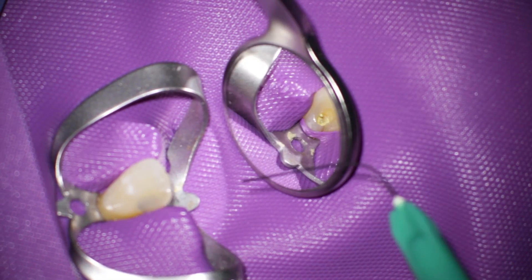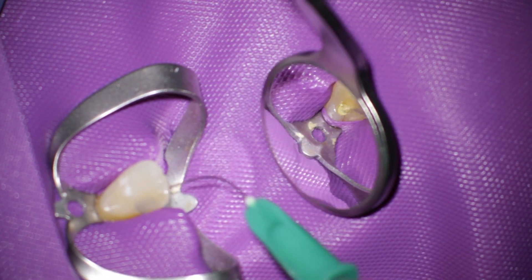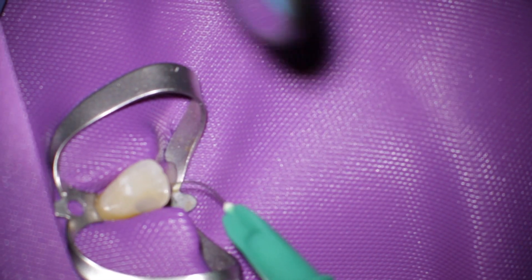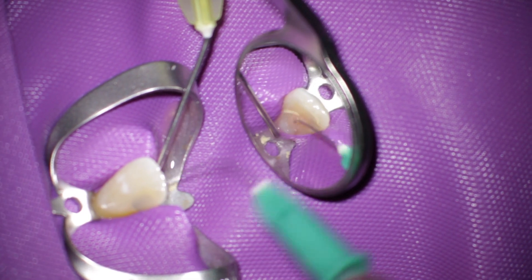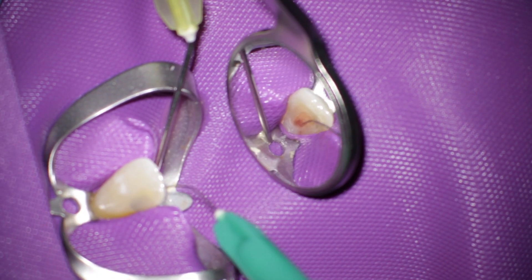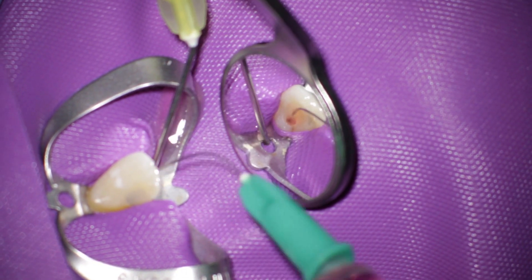Here you can see a tooth which I have treated last week. The tooth was open and there was a little bit of cotton in the tooth and some kind of medicamental paste. I don't know exactly what it was.